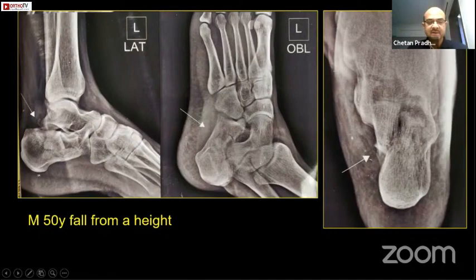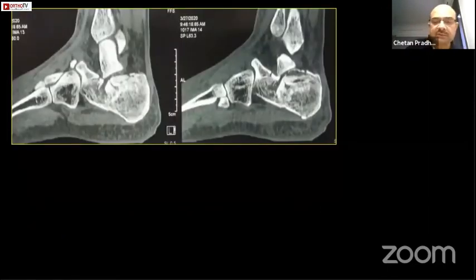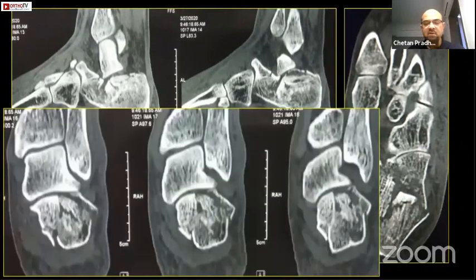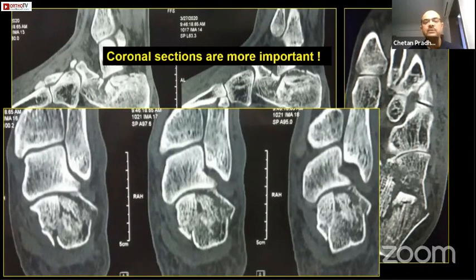This is a case — a 50-year-old gentleman, fall from a height. You can see quite bad joint depression here as well as multiple fracture lines. This is the CT scan. A word of caution when you do a CT scan: you must insist on coronal cuts, because quite a few centers don't give you coronal cuts and then you cannot visualize the subtalar joint or the facet well. Coronal sections are very important and you have to tell the radiologist to give you all the views of the fracture in coronal sections.